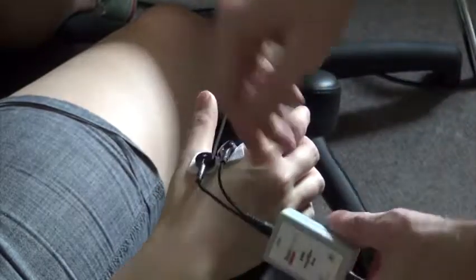EMG electrodes are placed on the hand to help determine the participant's resting motor threshold, or RMT.